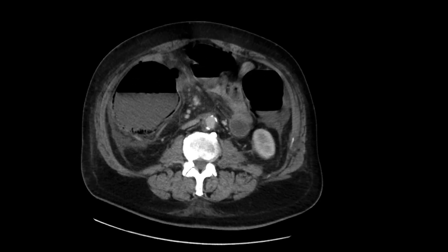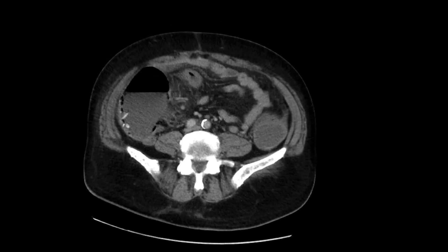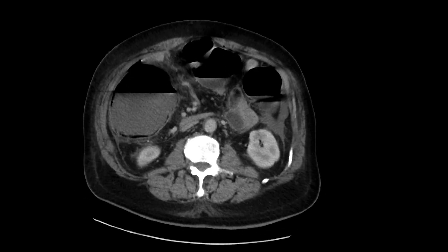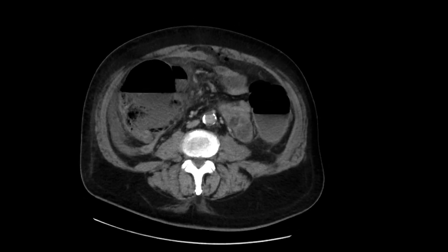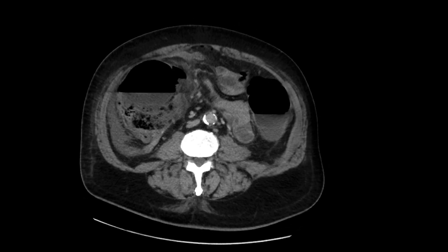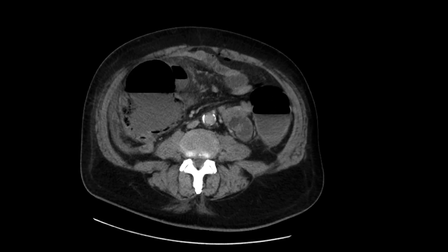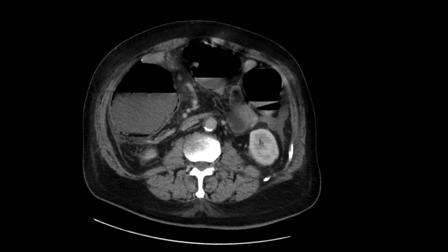So this was a large bowel obstruction due to a sigmoid cancer. This also resulted in ischemia of portions of the bowel, certainly the cecum, resulting in pneumatosis and rupture and pneumoperitoneum.